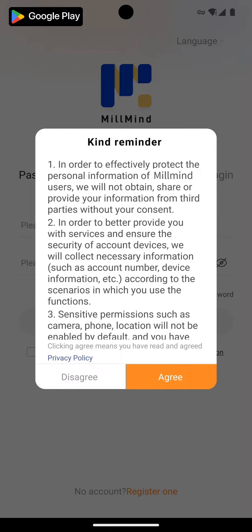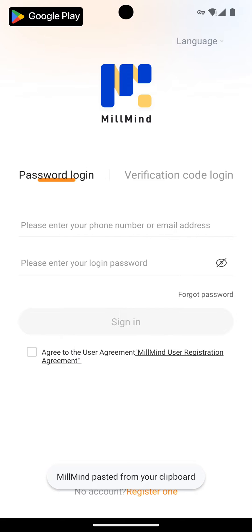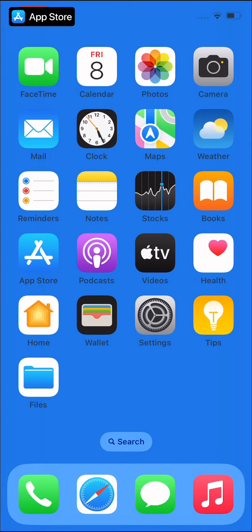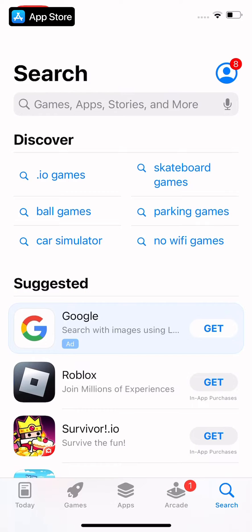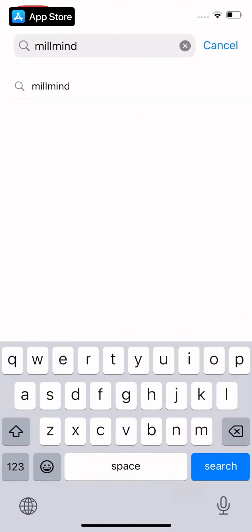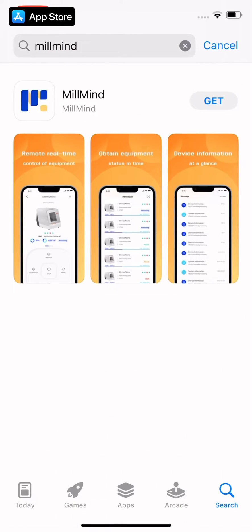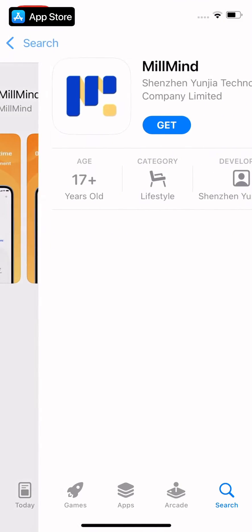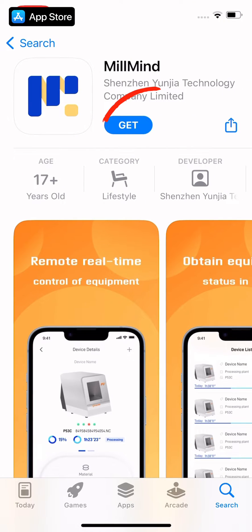Click allow to allow the software to send you notifications, then click agree to agree to our user agreement. The software is installed. If you are using an iPhone, open the App Store, enter MillMind and click search. Find the MillMind software in the search results and click get to download.